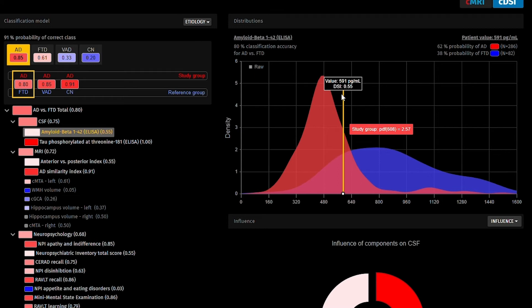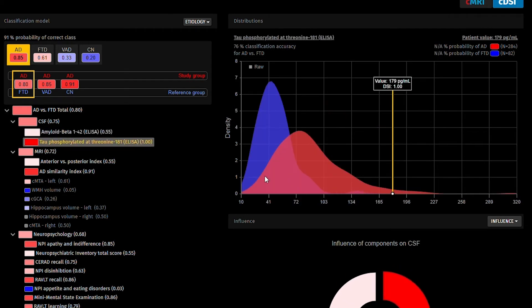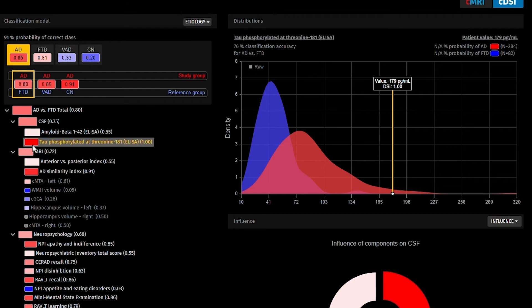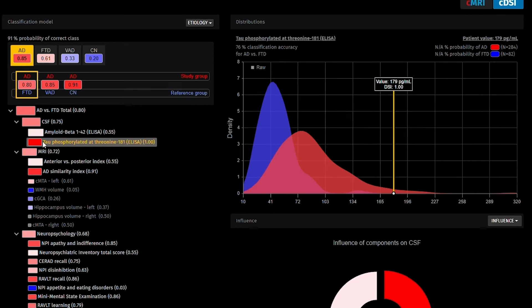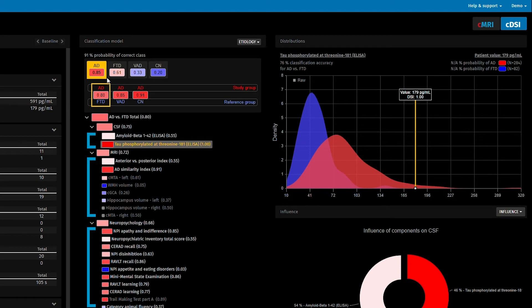Here, we see that DSI is close to 0.5 and the color of the box is white. If we click on the biomarker tau, we see that DSI is 1 and the color of the box is red. The size of the box shows the relevance of this particular biomarker in distinguishing between the disease groups of AD and FTD in this case.